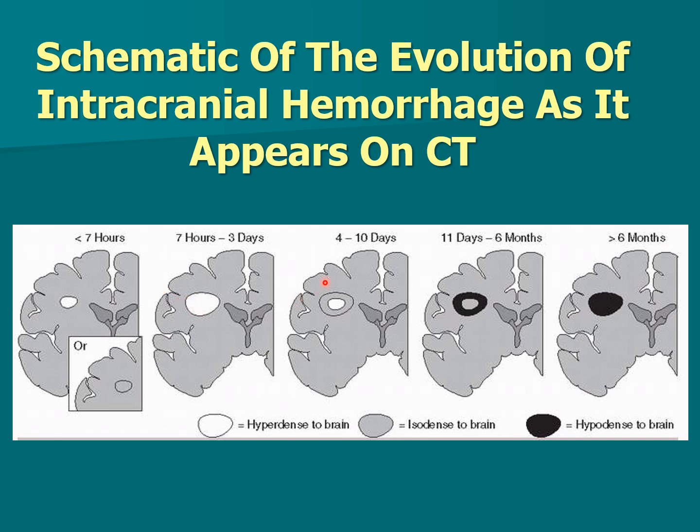After the bleeding stops, for anywhere from 4 to 10 days, the center is going to stay dense, but you start losing density on the outside. And as this tissue dies, necrosis, it's just going to be absorbed, and it would just be fluid filled around here, and then this starts getting normal brain, and then after 6 months it will just be a blank spot there. So it goes from hyperdense to isodense to hypodense.